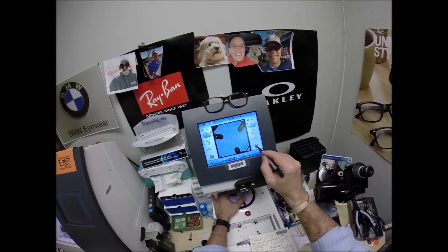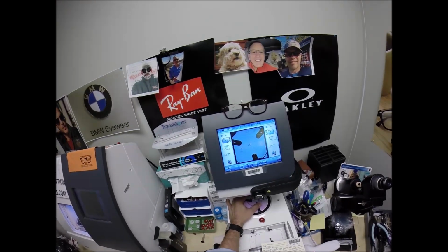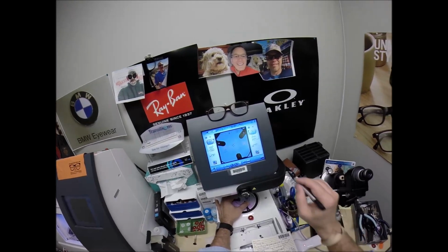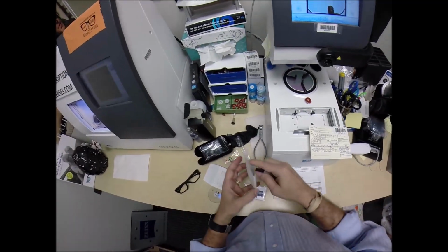Get everything laid out. Always like to make sure the lens is large enough to fit into the frame. It's just something I always do. It's how I document how the lenses are going to look. Hit that button, the arm comes down, places the block onto the right lens. We're going to do the same thing now for the left lens.